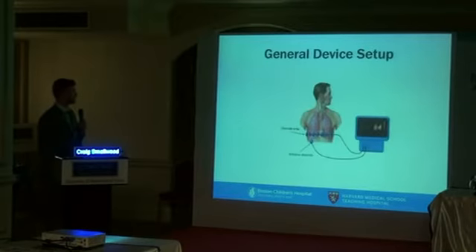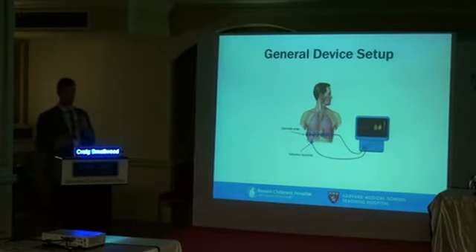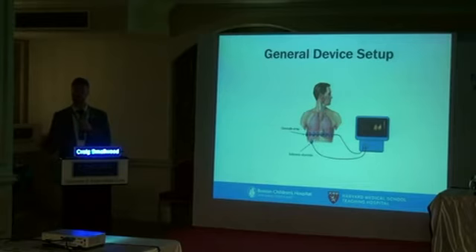So now let's get into EIT. So this is the general setup. So the EIT is a band. There are typically 8, 16, or 32 electrode arrays, and it can be either individual electrodes, whereby you would just place these electrodes circumferentially around the chest, or it can be a belt. The one we use with the Draeger device is a rubberized belt that has a bunch of the electrodes embedded into it. And so all you do is strap it around the chest of your subject, make sure there's good contact with all those leads, and you have a reference electrode here, plug those both into the box, calibrate it, press start, and that's pretty much all there is to it.